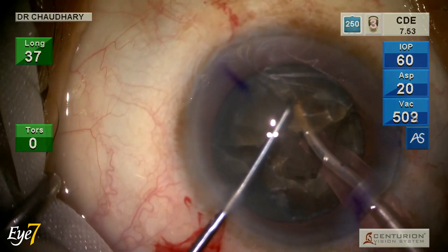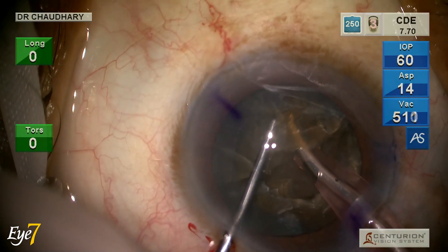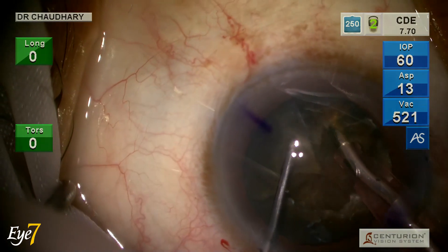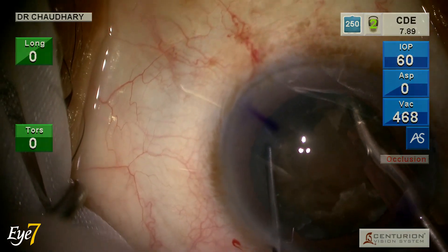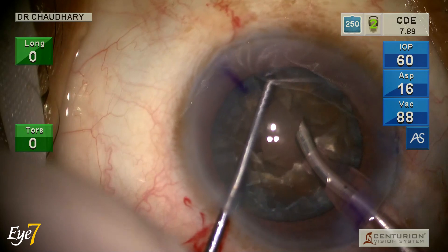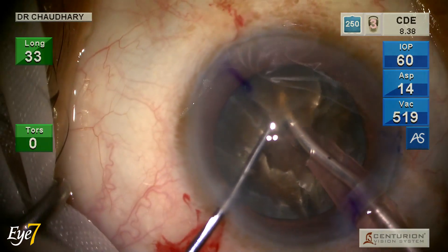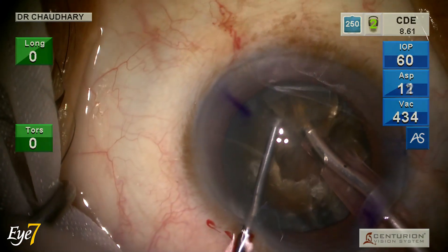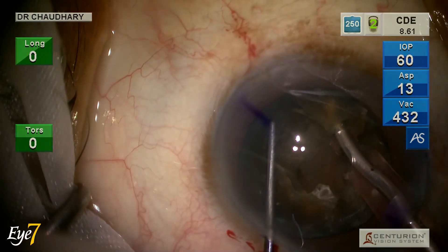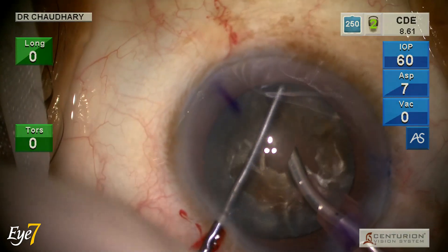This is where you need longitudinal phaco. Longitudinal phaco only moves to and fro, not side to side as in torsional phaco. The to-and-fro movement buries the tip into the substance of the nucleus. A torsional or side-to-side phaco would open up a tunnel, reducing the grip on the nucleus.